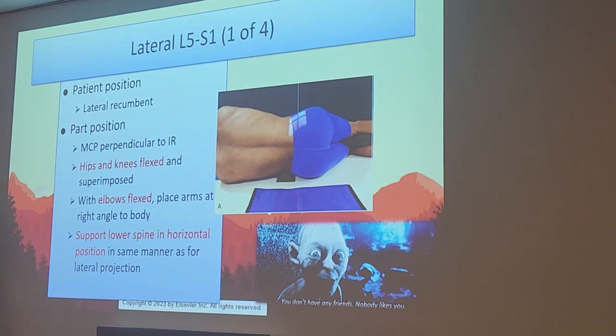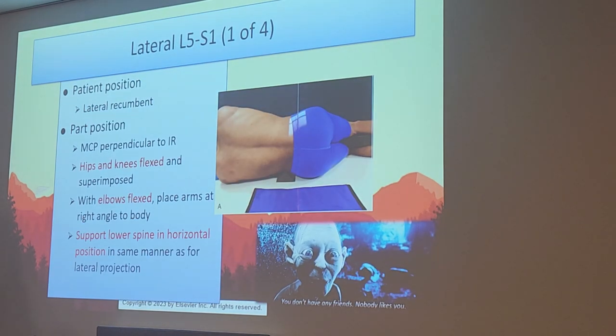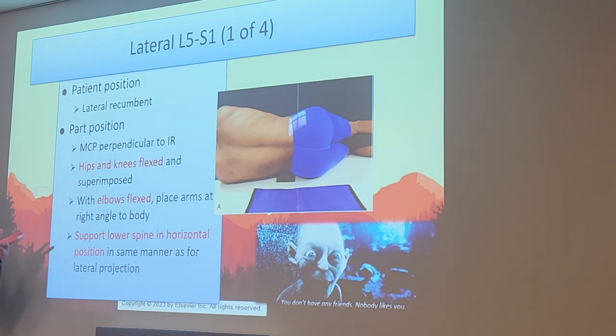All right, so for part position, we're going to jump ahead to L5S1. I think the evaluation criteria is coming up here in a second. It's combined together. So, as part of that series, of course, we also do what we call the L5S1 joint space, or our spot film, which most techs will call a spot film.